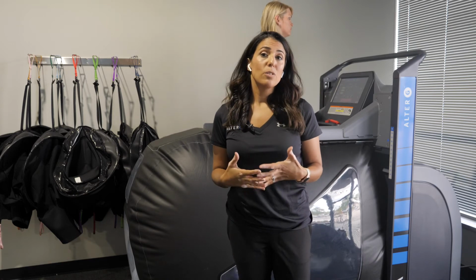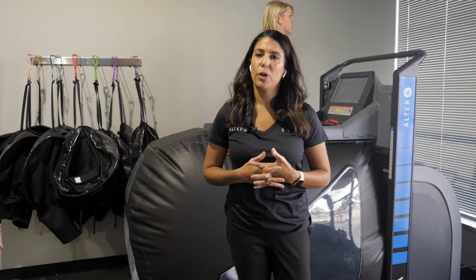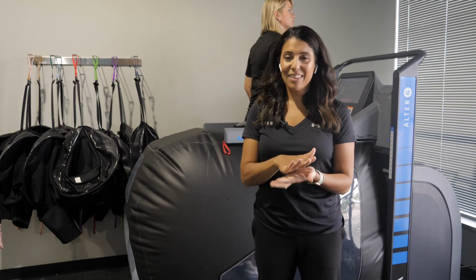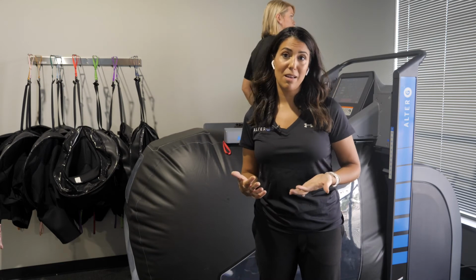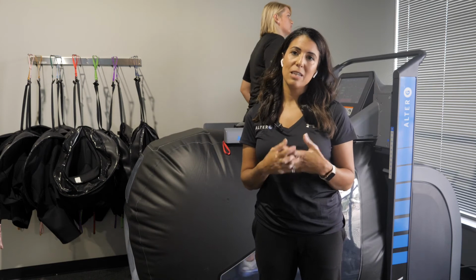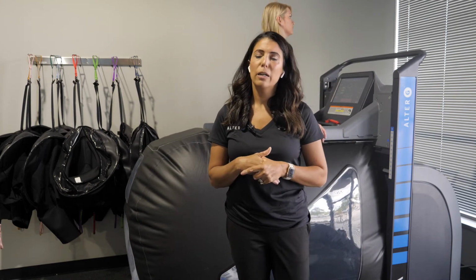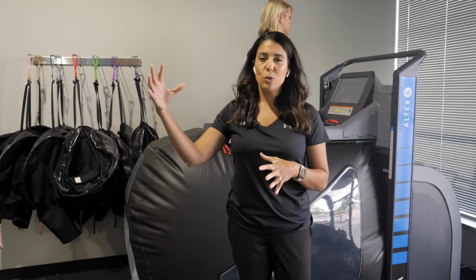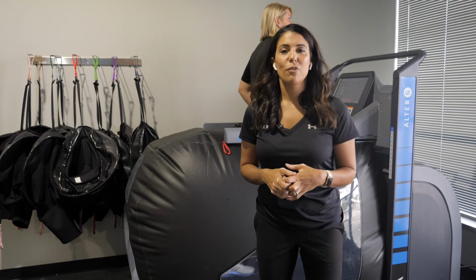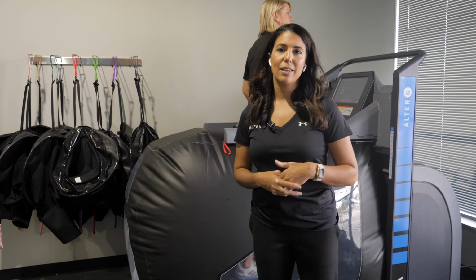The data really is most accurate when we're walking with a fairly low level of body weight support. If I unweight a patient and I remove 80% of their body weight, again, the level of impact on the treadmill is close to none at that point. So again, those load cells aren't going to be getting all that strong data to give us some nice accurate measures. So just keep that in mind when you are using the software, that if you're unweighting too much, or if you're running at a really fast pace, the load cells aren't going to get as much information, and therefore the accuracy won't be as good as traditional walking at a normal gait speed.